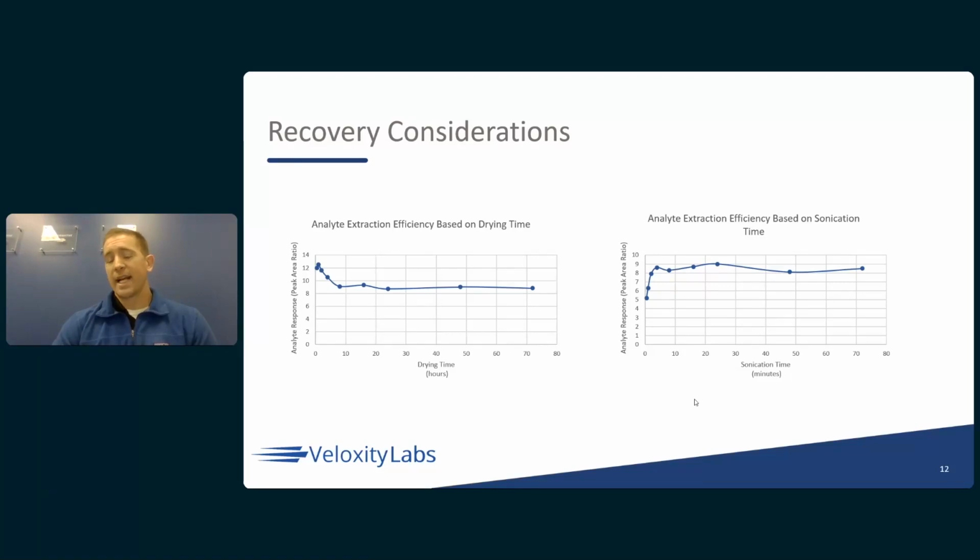One of them is just drying time. As I mentioned before, you're going to add these samples and the blood is going to be wet. And then over the course of maybe a couple hours, it's going to dry. And of course, we want our standards and QCs to match our patient samples as closely as possible.